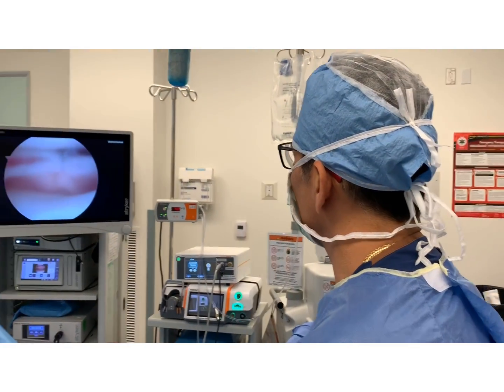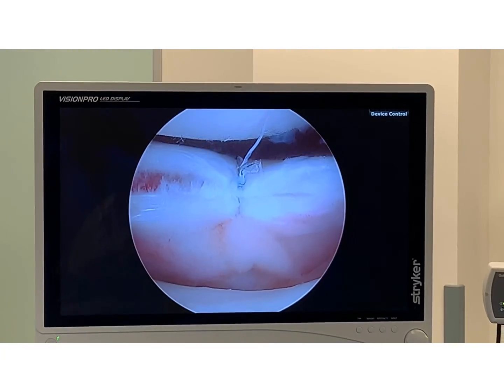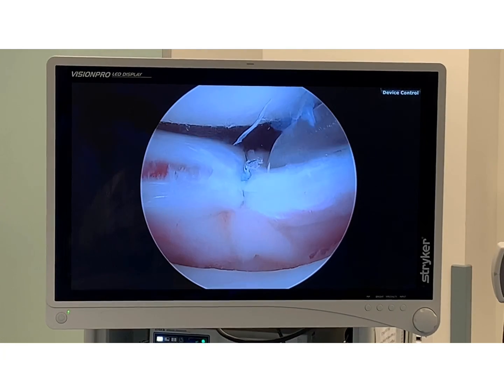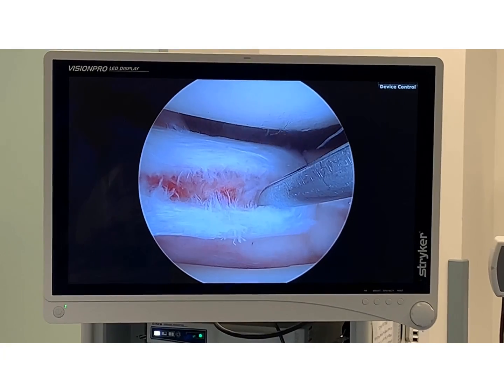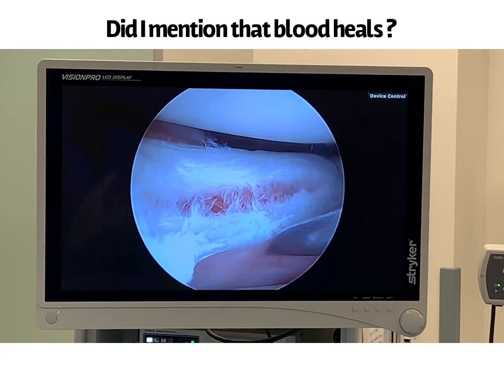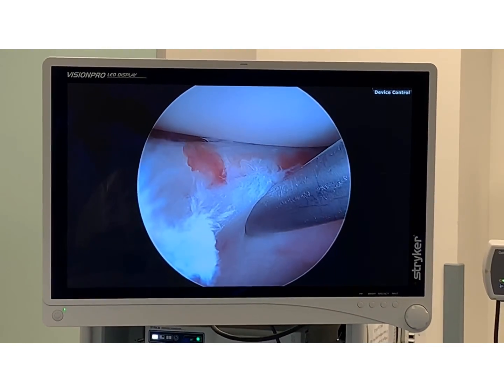Let me show you a nice close-up of this. Look at that right there — it's squeezing those two fragments of meniscus together. The upper leaflet and lower leaflet squeezed tight. You can see the bleeding right there. Remember, blood heals — without blood nothing heals. So that's why there's nice bleeding tissue there. I'm going to close that up, and that'll be the next stitch.